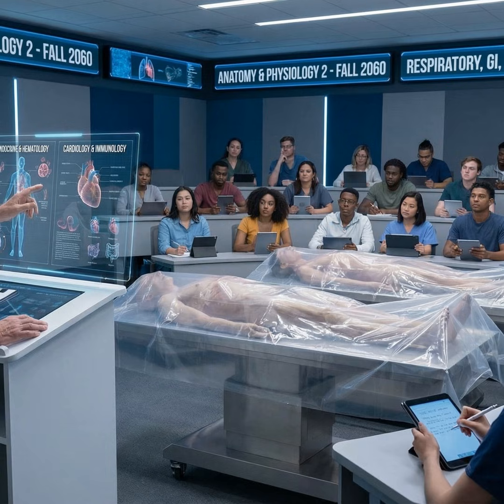So we're on to step 3. We need a tiebreaker. This is how we're going to differentiate between diseases that can look pretty similar, like telling emphysema apart from chronic bronchitis. And this is where your secret weapon comes in, the DLCO. Okay, so DLCO measures how well gas gets from your lungs into your blood. Think of it like this. In emphysema, the lung walls are literally destroyed, so gas can't cross. That means your DLCO is low.